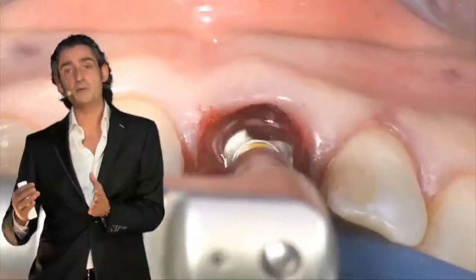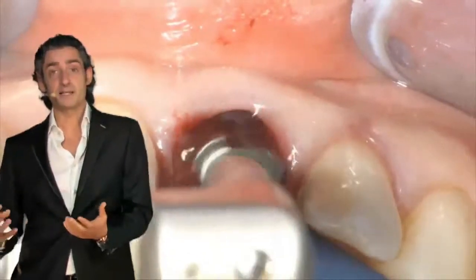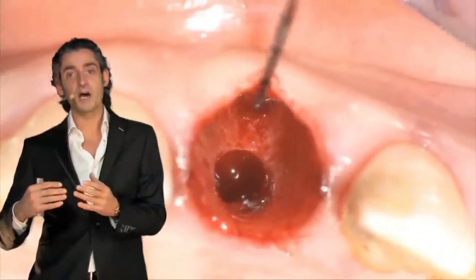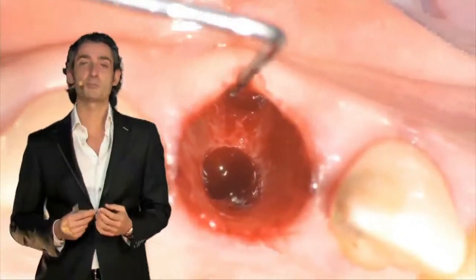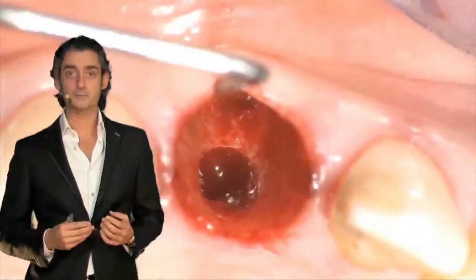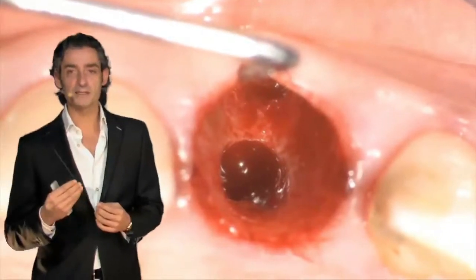Sometimes we have the need to under-prepare, because if we make a normal preparation, we can lose some stability. Under-preparing means obtaining the same torque, even if our implant, especially on the buccal side, is not in the bone. Look here. Right now it's possible to see, for example, where the axis of the root was and where the axis of my implant is right now. And then we can start to place our implant in a normal way, trying to maintain the axis.